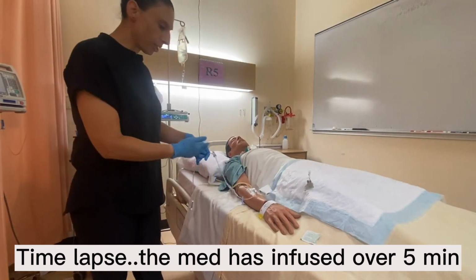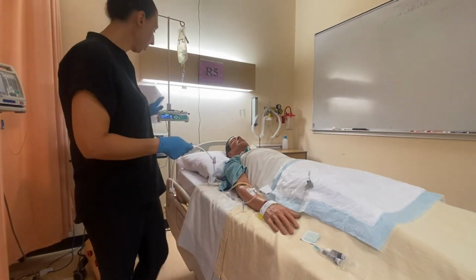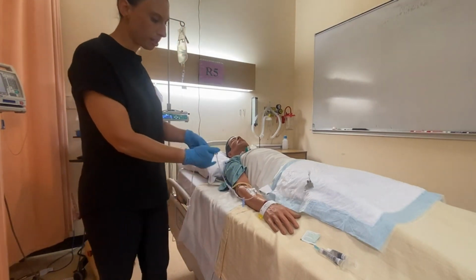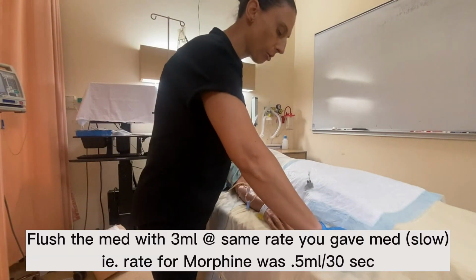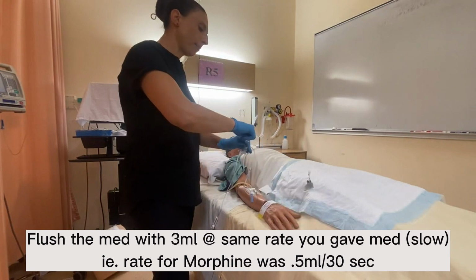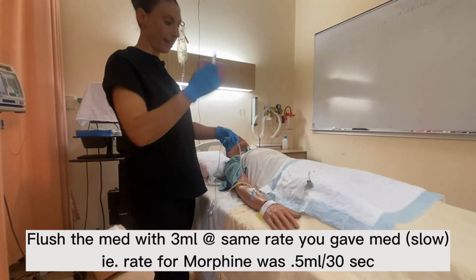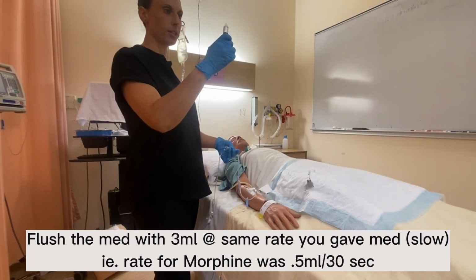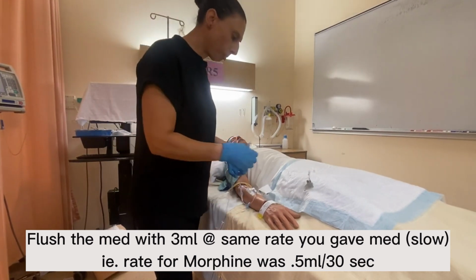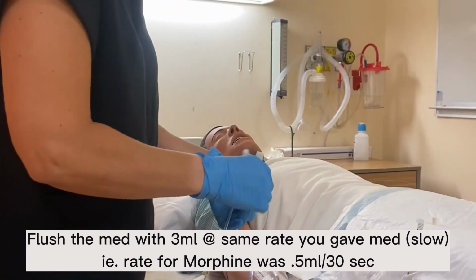Now, we need to flush the tubing after. So there's morphine sitting in this line. The primary is still running, but that means this medication is going to be really slow to get into the patient. So what we're going to do is flush the IV. However, we don't want to flush it quickly, because then they're going to get that residual morphine really fast, faster than we want them to get it.